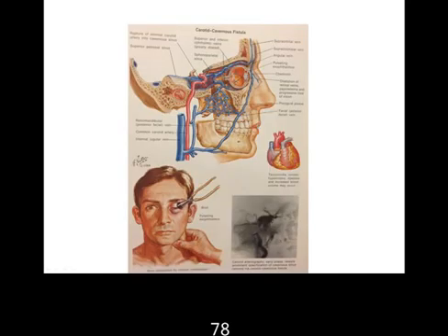This patient has a pulsatile exophthalmos. Basically, you can put a stethoscope over the eye and hear the pulsating mass, and the eye is bulging out. This patient has a so-called carotid cavernous fistula. So basically, the artery is bleeding right into a next door vein, and the vein is not used to handling that much blood flow that fast from the arterial side. So the vein is getting dilated, and also arterialized, and then it pulsates the entire eyeball. And then you can use a stethoscope to listen to it.